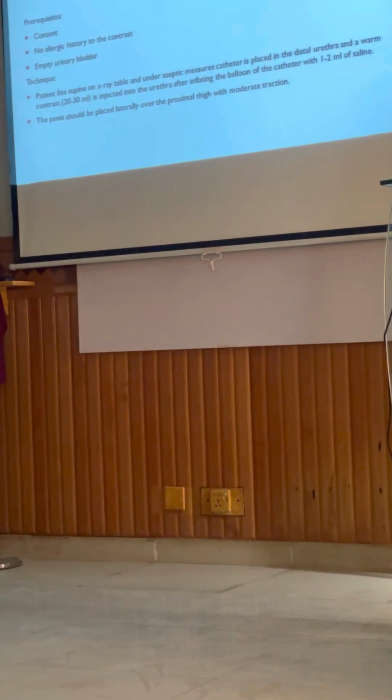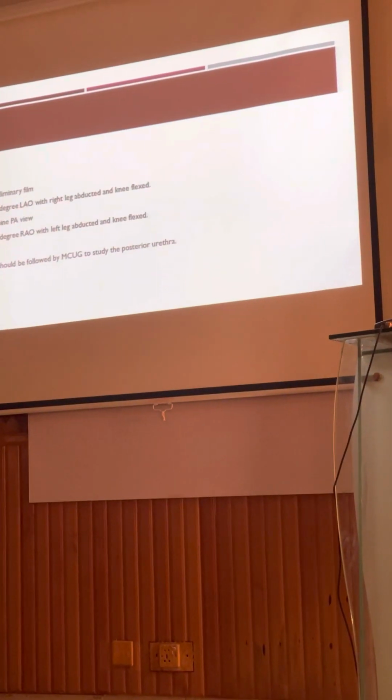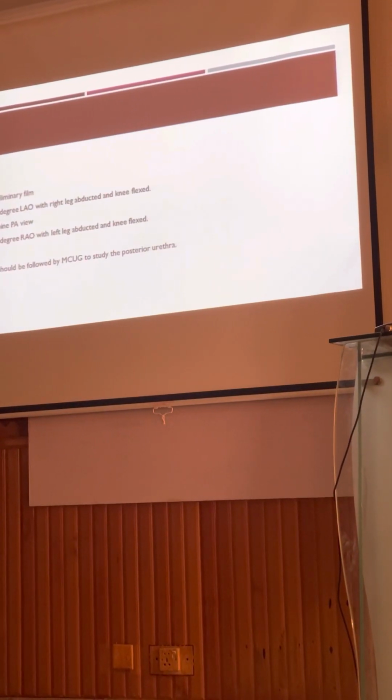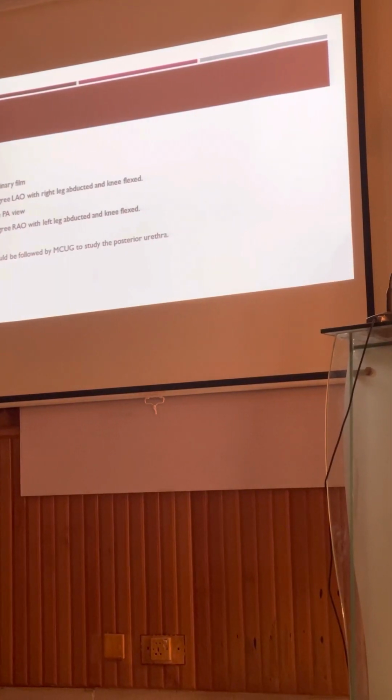Now the penis should be placed laterally, along the proximal thigh. We will take several images, which is basically the job of a radiologist.